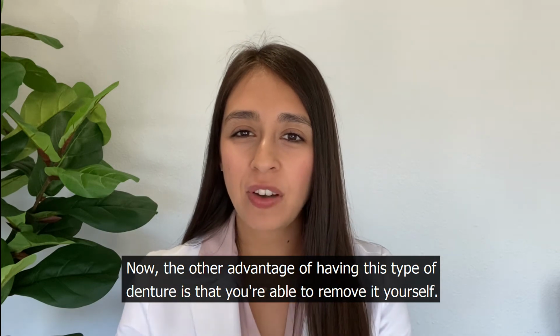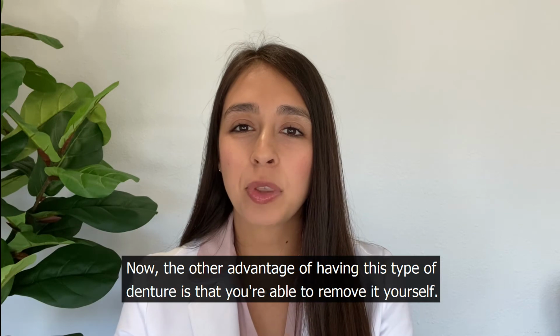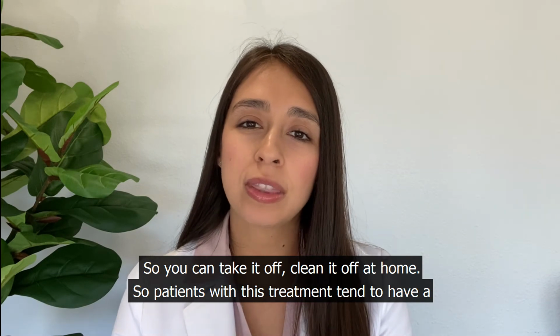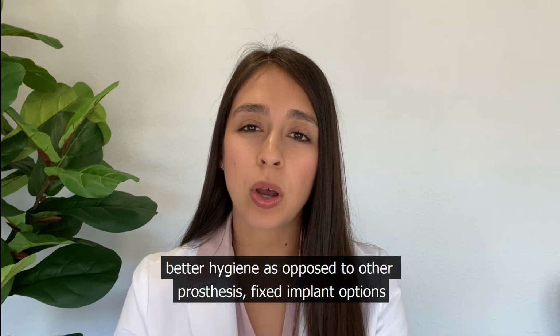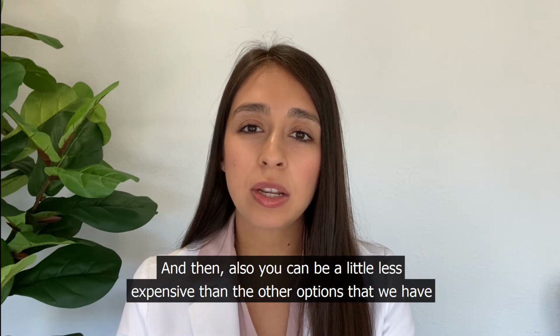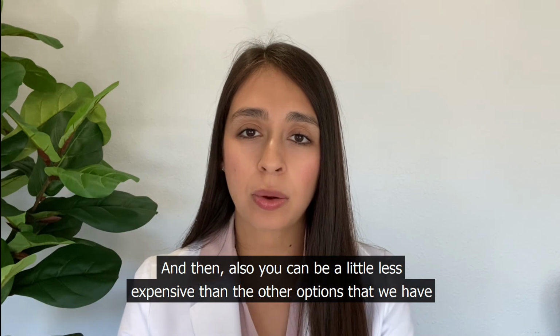Now, the other advantage of having this type of denture is that you're able to remove it yourself at home. So you can just take it off and clean it at home. So patients with this treatment tend to have better hygiene as opposed to other fixed implant prosthesis options. And then also it can be a little less expensive than the other options that we have.